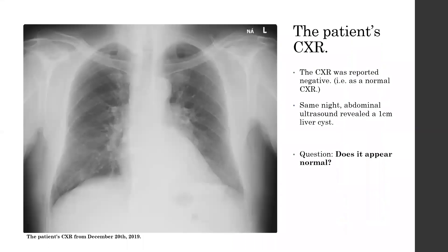This was the patient's chest x-ray from the day he visited the ER, and it was reported as normal — negative, meaning normal — by the reading radiologist. The same-night abdominal ultrasound also revealed a one-centimeter liver cyst. But one thing to question is whether this chest x-ray is really normal.